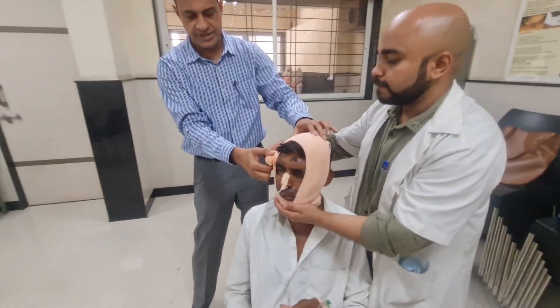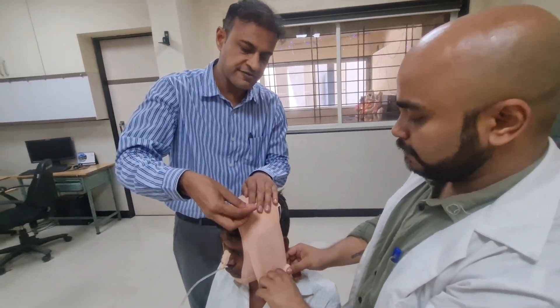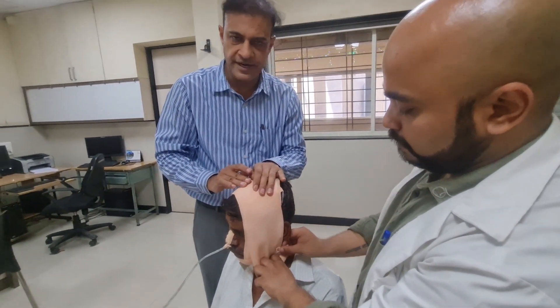Lastly, we again turn the crepe bandage upwards and fix it with the clips. This is the Barton's bandage.